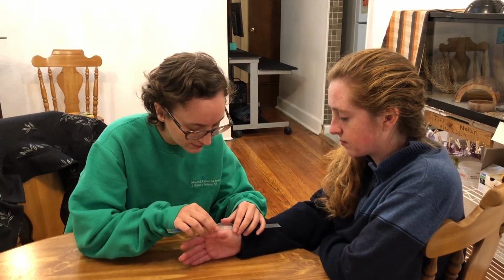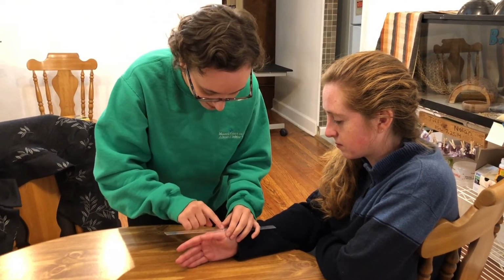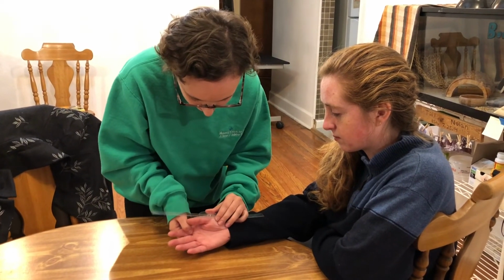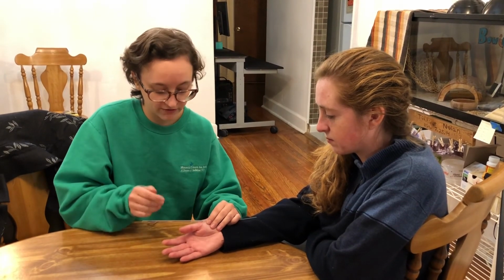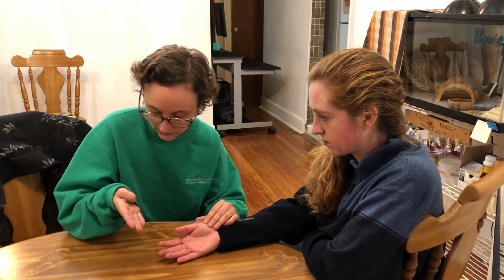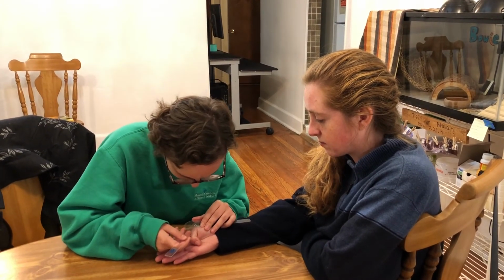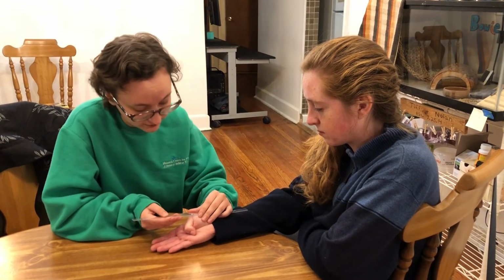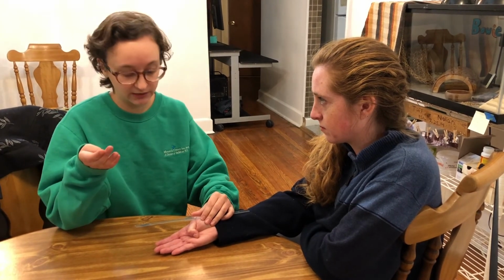So what I'm gonna do is line up my stationary arm in line with the wrist, and I've got my fulcrum on the MCP joint, and I'm actually gonna have you turn your hand a little bit for me because this is kind of long. When you go to flex, I would hit the table and it would give me an incorrect reading. So go ahead and just flex your thumb like so. Okay. Okay, I'm getting 55 degrees for MCP flexion, which is good because MCP flexion is usually 0 to 50.